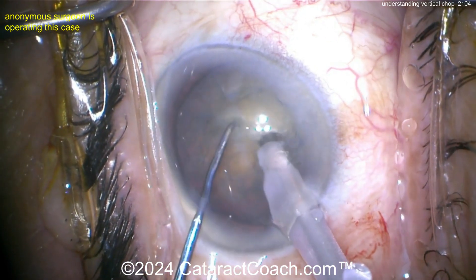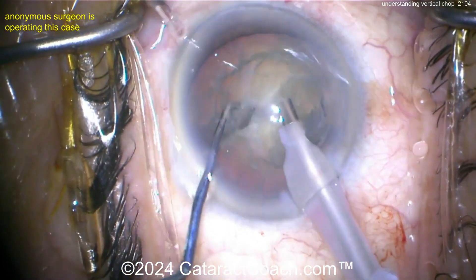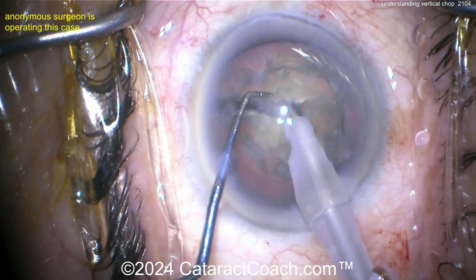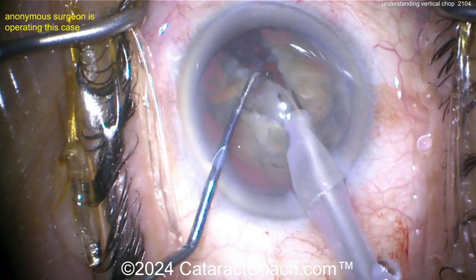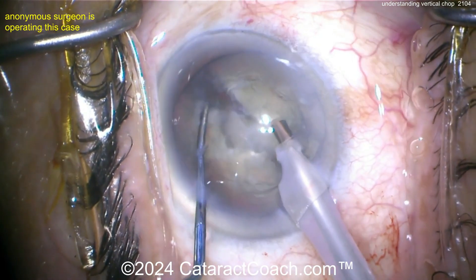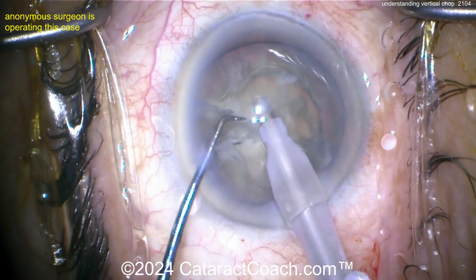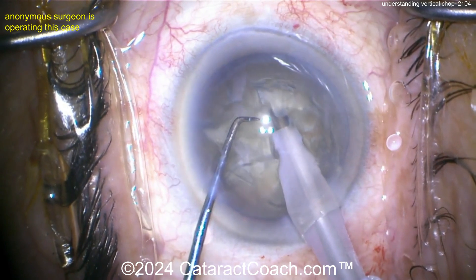The chopper goes inside the nucleus, digging in, and then the instruments get pulled apart. The key difference is the path of the chopper — it's moving vertically, going from the top of the anterior surface of the nucleus down into the meat of the nucleus, moving in a direction from top down towards the optic nerve.